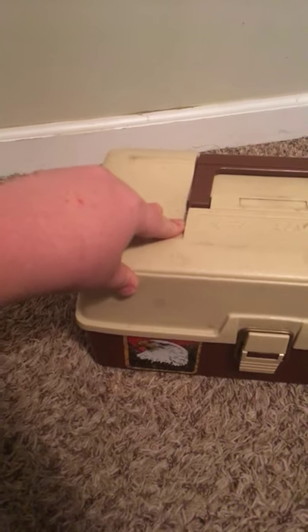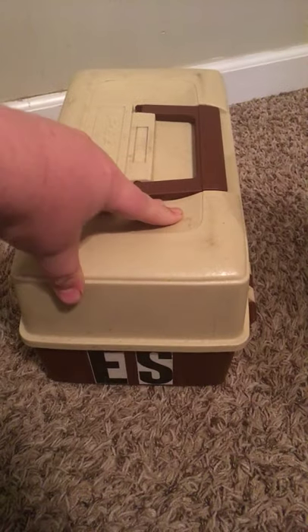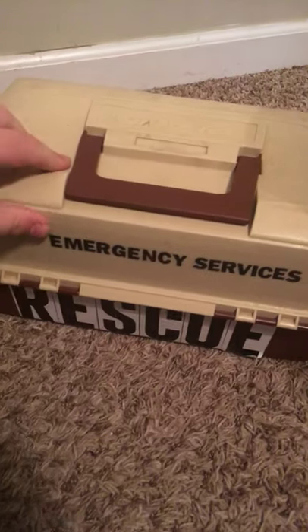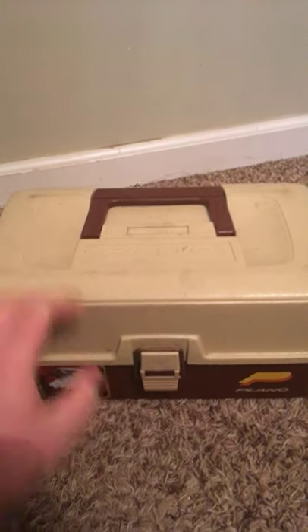This is a Plano box, an old one. It was originally my dad's from when he worked for a sheriff's rescue department — emergency services. Most of those stickers were just falling off, so I took them off and left the ones that were still intact. Let's open it up.